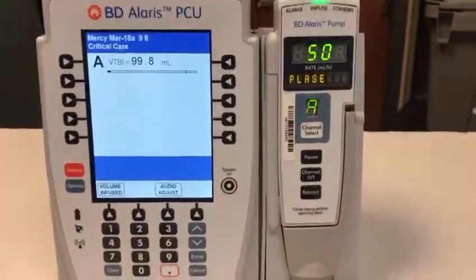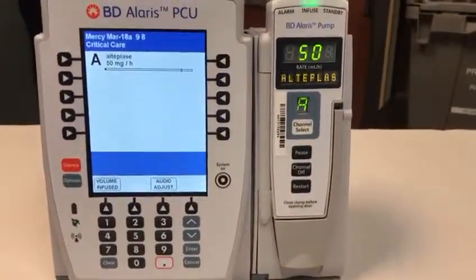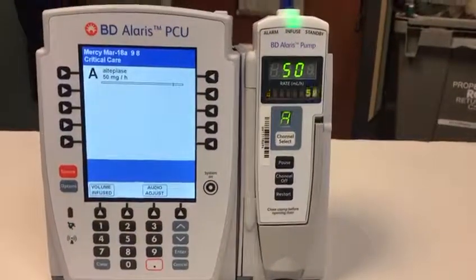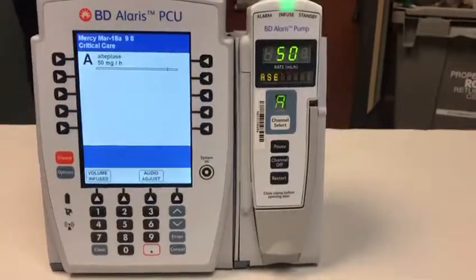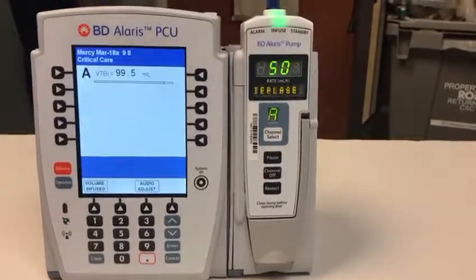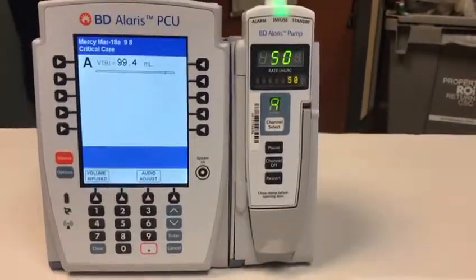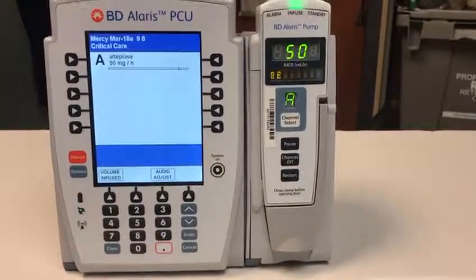So just to recap, this is TPA or alteplase, 100 milligrams in 100 mils. That is going to be delivered over a 2-hour time frame for a patient diagnosed with acute pulmonary embolism. It is a dual verify medication. It does require consent from the patient. You should have at least 2 IVs already inserted into the patient, and consider the need for a Foley, which should also be inserted prior to TPA. Other than that, you'll want to watch your patient for at least the first 30 minutes to see how they react to the TPA and make sure they don't have any untoward effects. And hopefully you'll find that to be helpful.